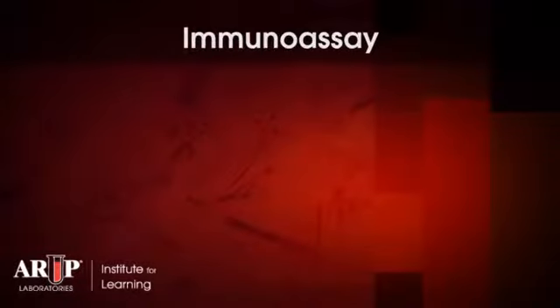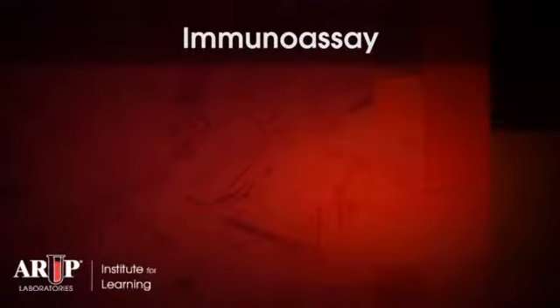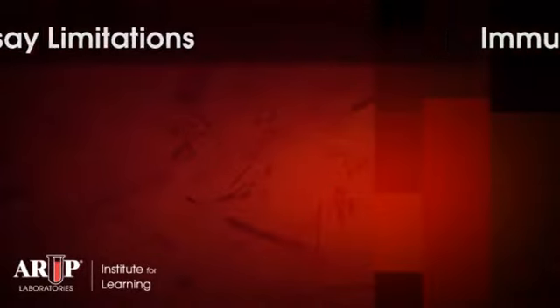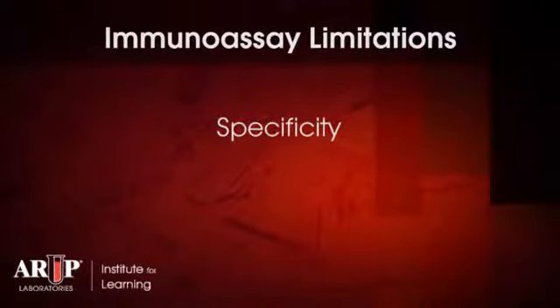As such, it's important to have a fundamental understanding of the strengths and limitations associated with various technologies applied to drug testing. The most widely used technology for drug testing is the immunoassay. Part of the reason that immunoassays are so widely used is that they're quick and easy and relatively inexpensive. However, there are a number of concerns about specificity and sometimes sensitivity of immunoassays.